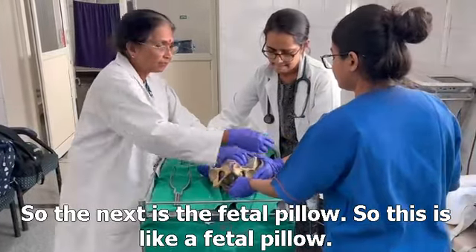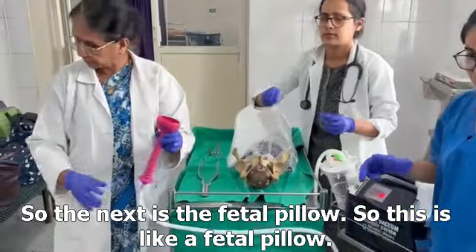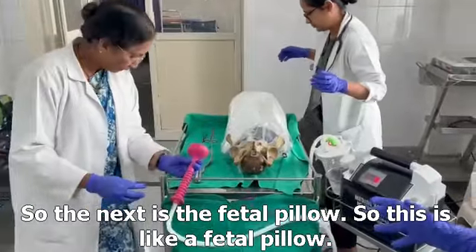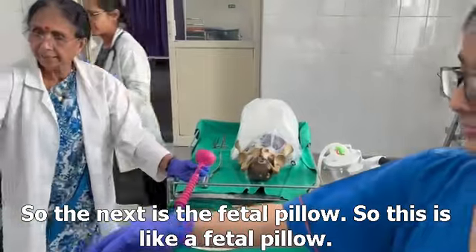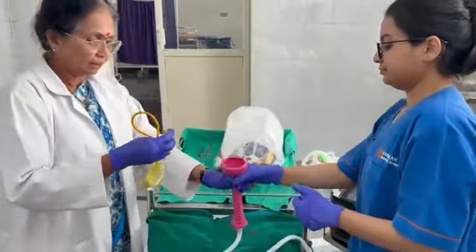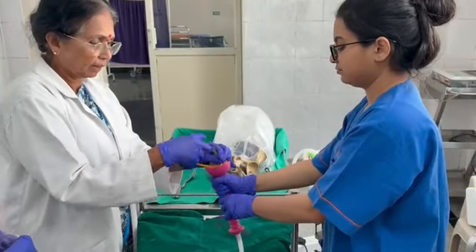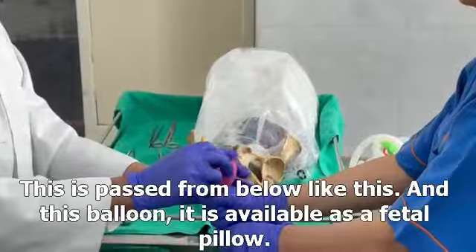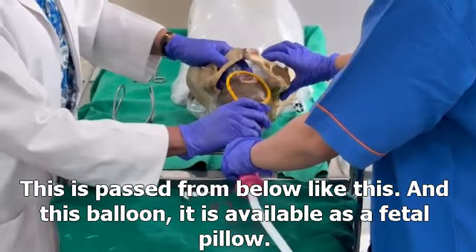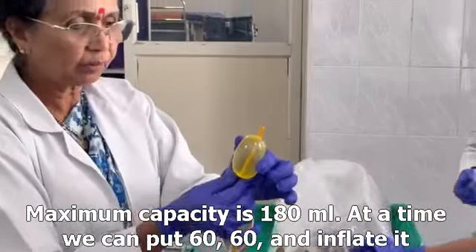So the next is the fetal pillow. So this is like a fetal pillow. It is passed from below like this, and it is this balloon. It is available as a fetal pillow.